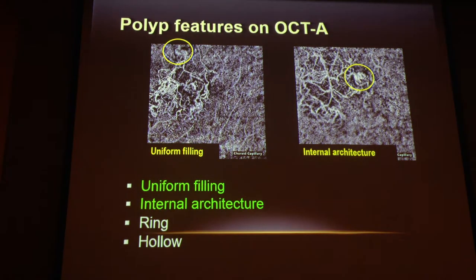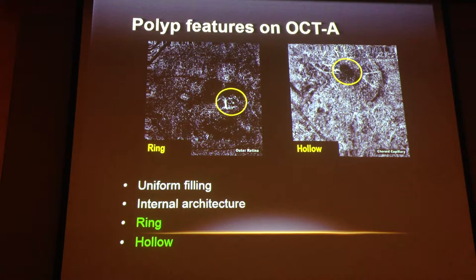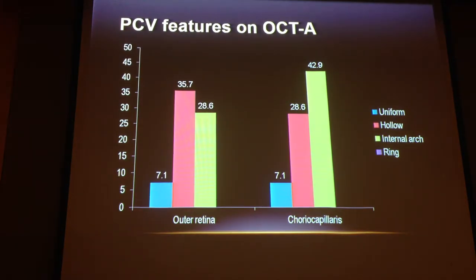We looked at different patterns of the polyp on OCTA. There's a uniform filling where the intensity is quite uniform throughout. Some polyps appear with internal architecture where you can see gaps, reflecting the structure of the polyp. In others, we see a bright ring around the region where the polyp is. And unfortunately, in many cases we see just a hollow area. The question is: would we confidently call this a polyp using only an OCT angiogram? That's the current challenge.